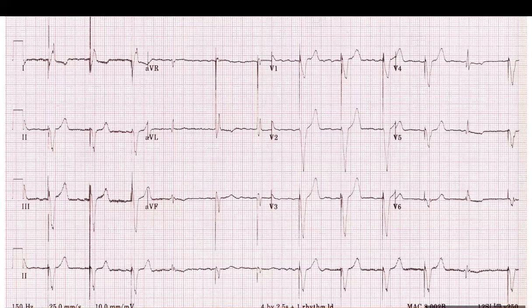So in atrial fibrillation and a ventricular paced rhythm, this device, is it single or dual? Single. Are you sure? Yes, I am sure, because there is AF. The absence of evidence doesn't mean the evidence of absence. So it's behaving as a single chamber device. Most likely it is.